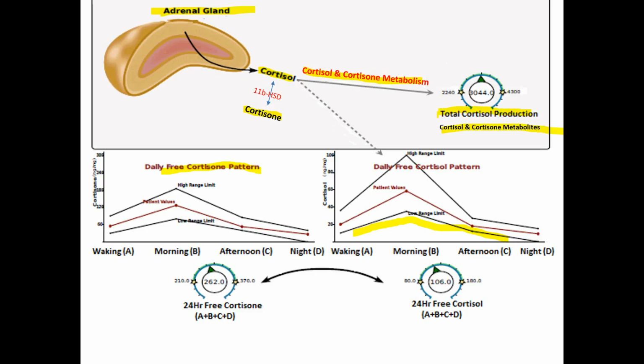And so in this particular case, the free cortisol is a bit on the low side, whereas the metabolized cortisol, it's not high, but it's higher, right? Which implies that maybe there's a little bit of increased cortisol metabolism, and the degree to which these metabolized cortisol are towards the elevated side would imply how much there's an increase in terms of that cortisol clearance.